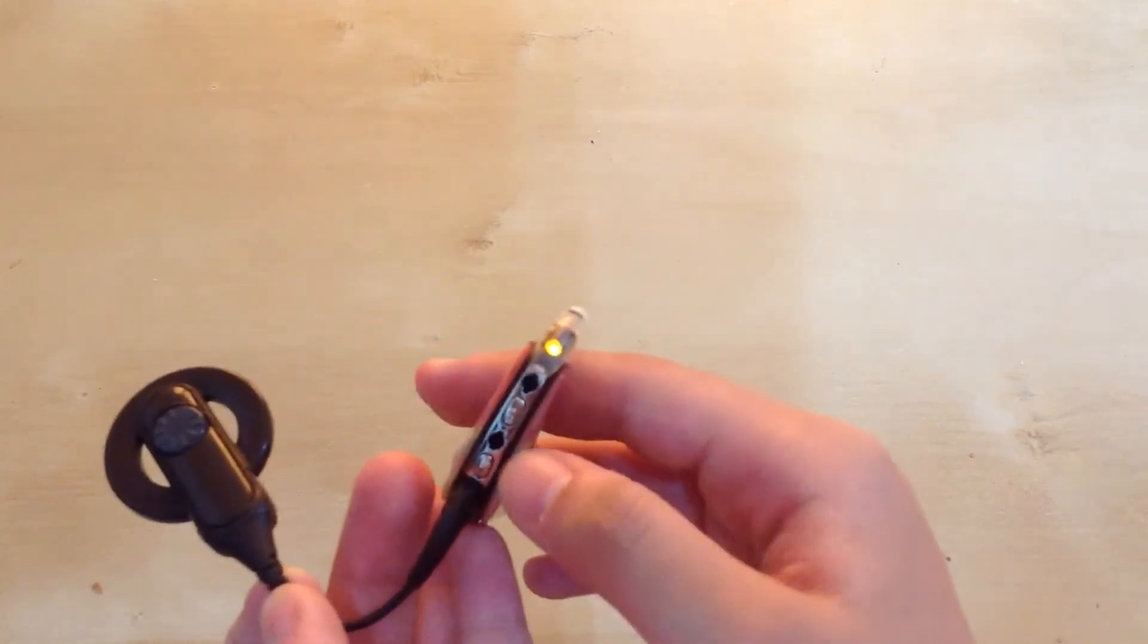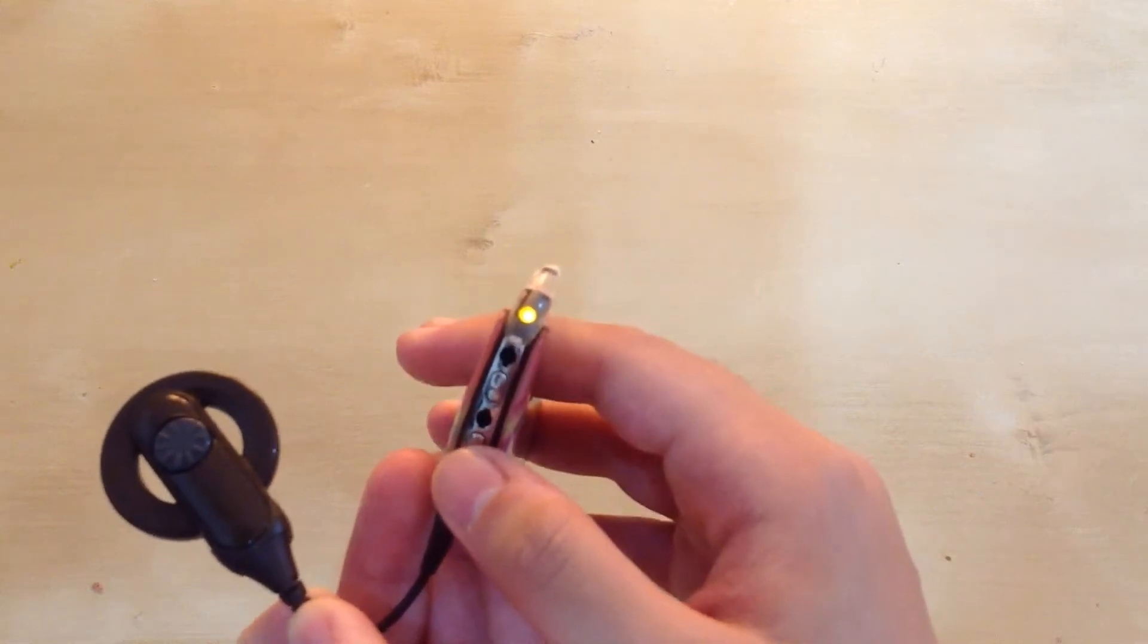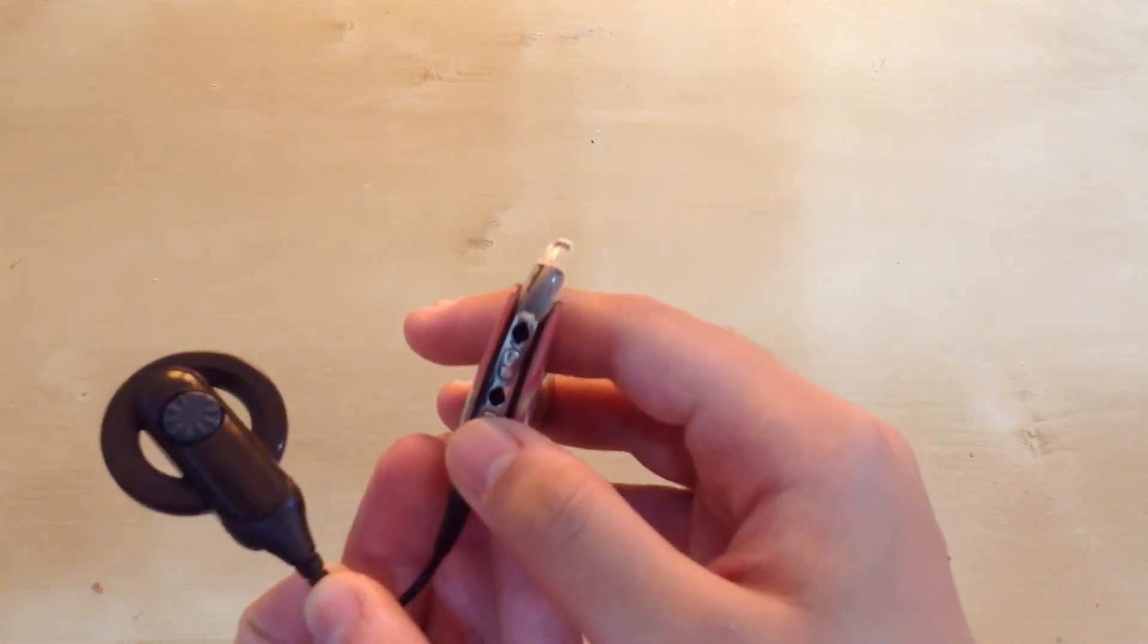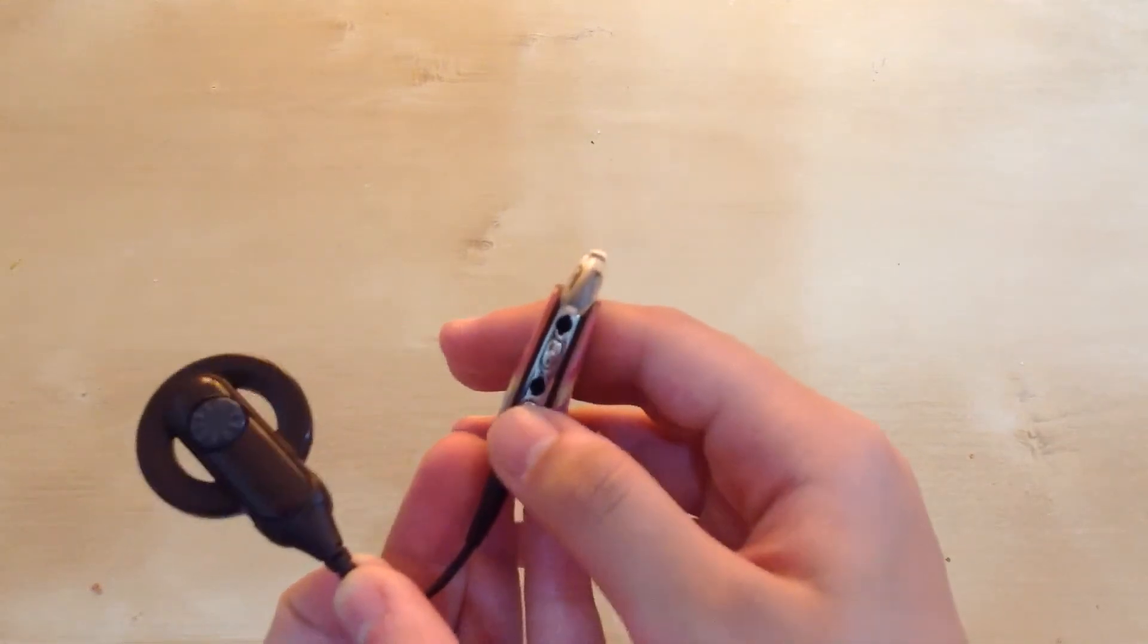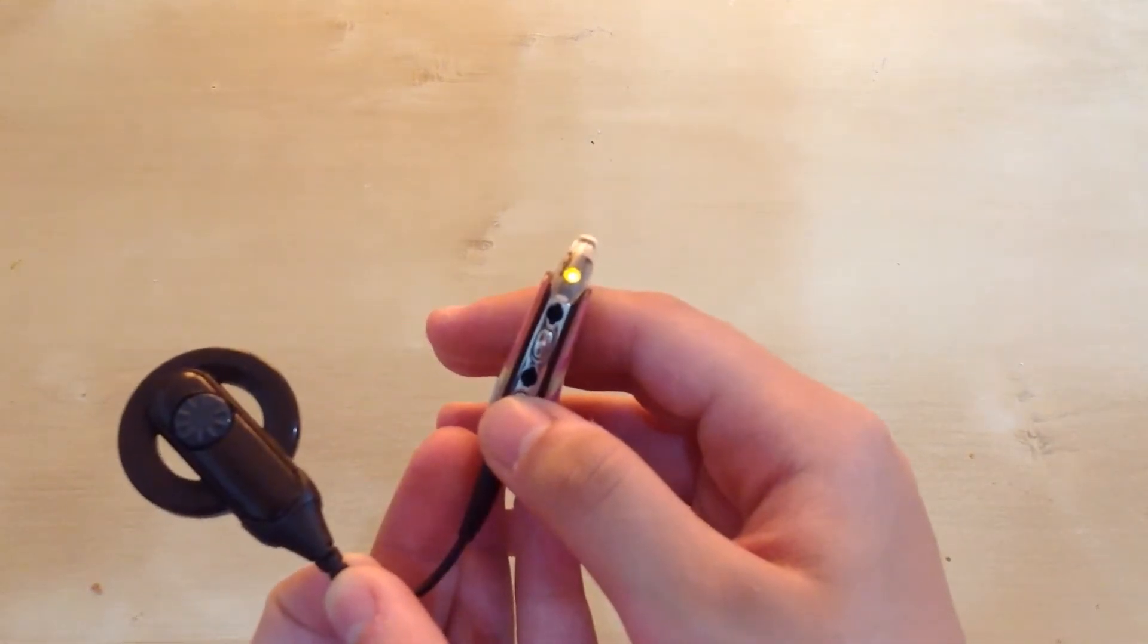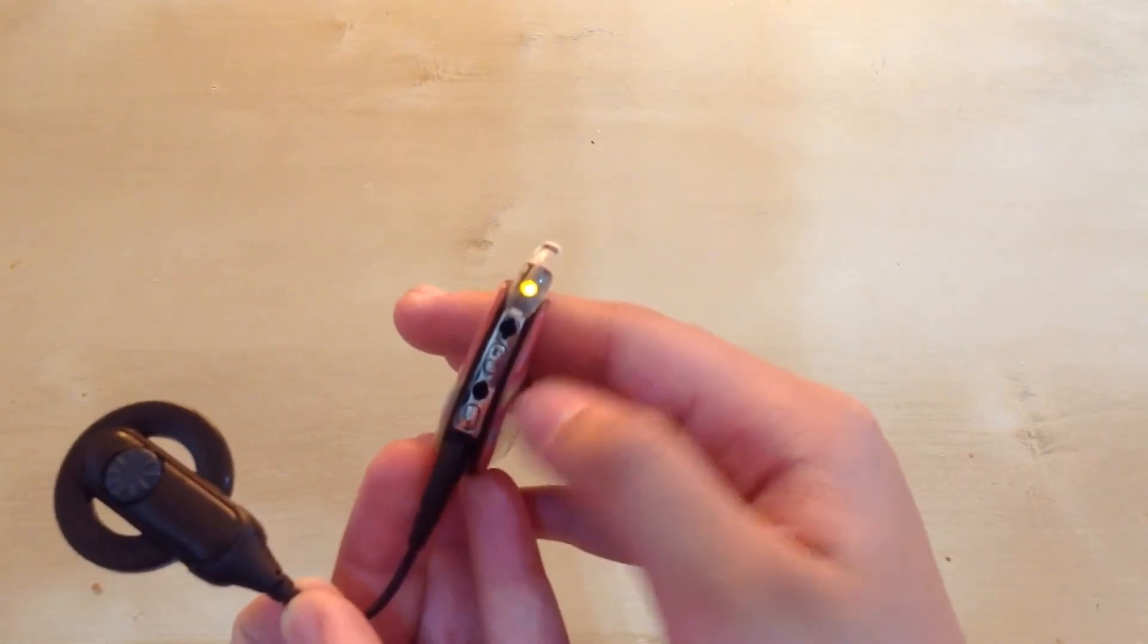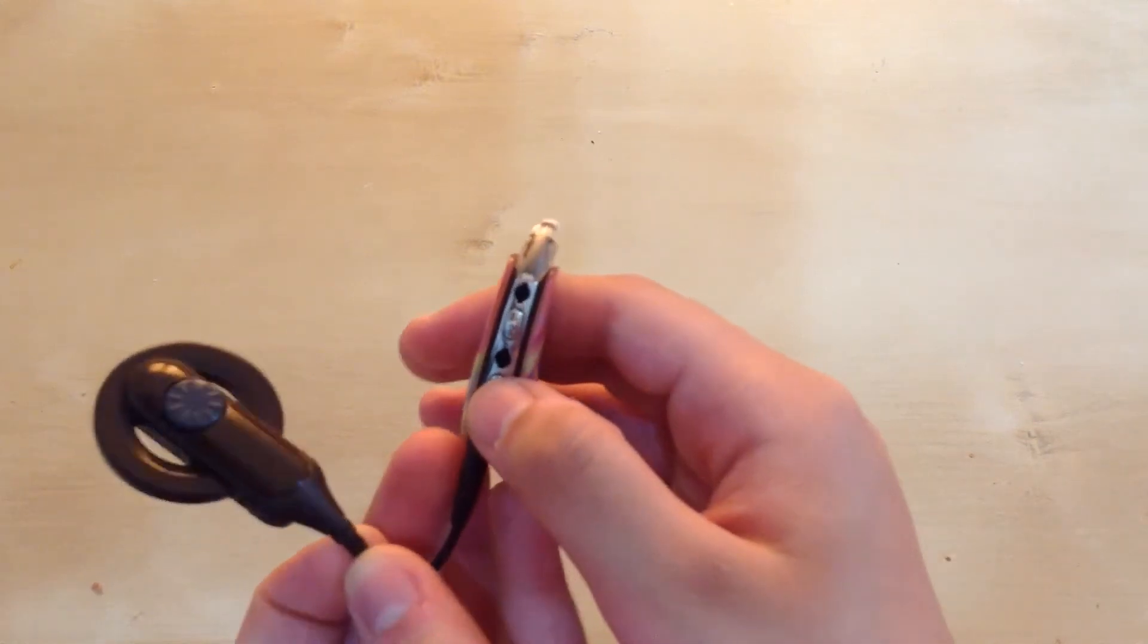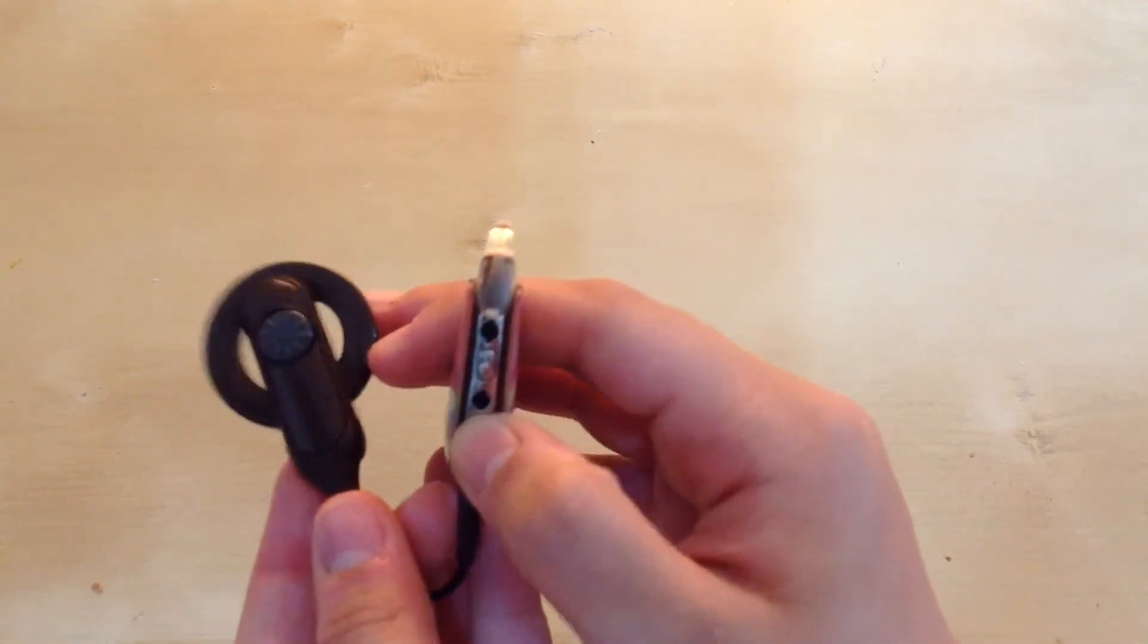If I were to change it to program two, then there would be two blinking lights. So I'm going to change it to program two right now.